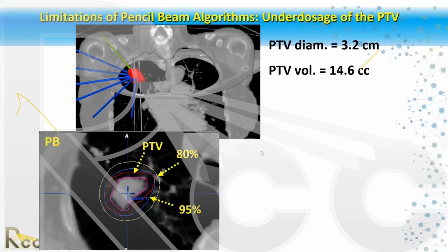One question. Right, so here's the, I'm sorry, Dr. Chetty, one question we have on the chat, and I think it goes perfectly with what you showed from the energy in the previous slide, is how often do you use an energy of 10 MV for SRS and SBRT? Yeah, so we typically use 6 for most of our SBRT lung, especially small lung tumors. I would say for SBRT, it's mostly 6.